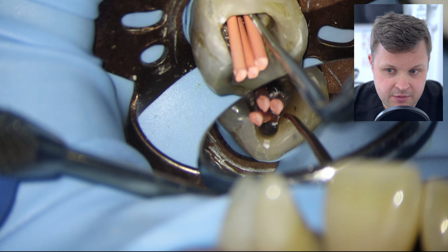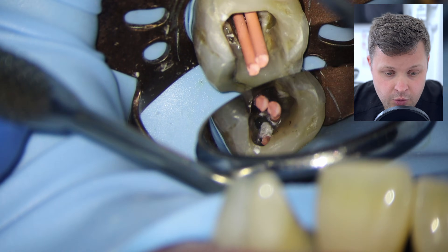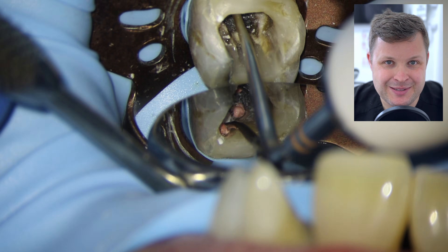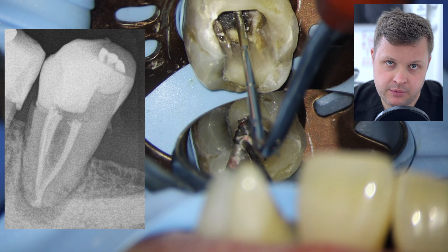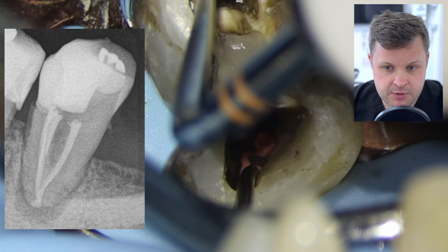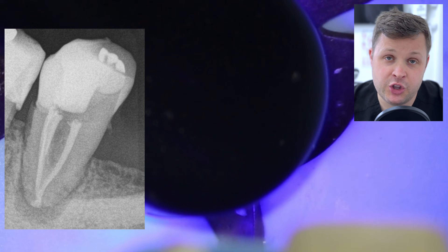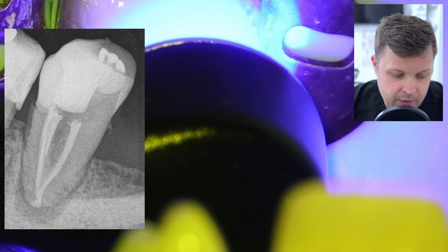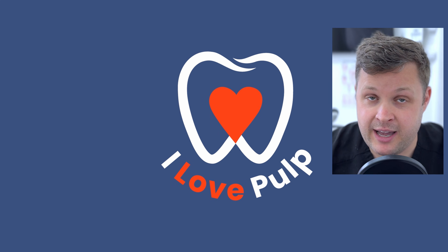Once all GP cones are nicely to length, I shear off excess with the heated plugger. 'Shear' is the right word here — with bioceramic sealers it's very easy to accidentally pull the GP point out with the heat plugger, which is really annoying. The X-ray looks absolutely gorgeous — a really nice filling from top to bottom, with the bioceramic sealer filling the unusual apical anatomy. No sealer puff, though it's not the end of the world if it does happen with bioceramic sealer.